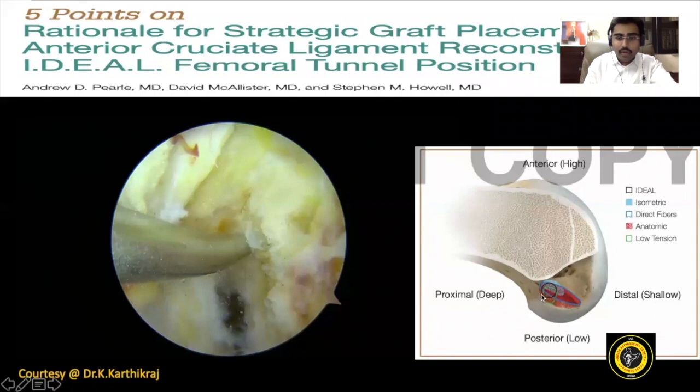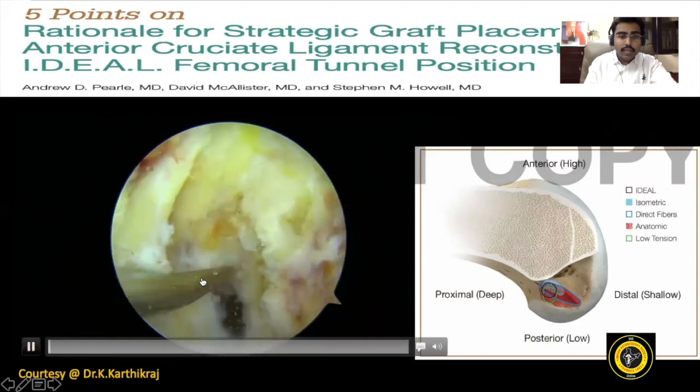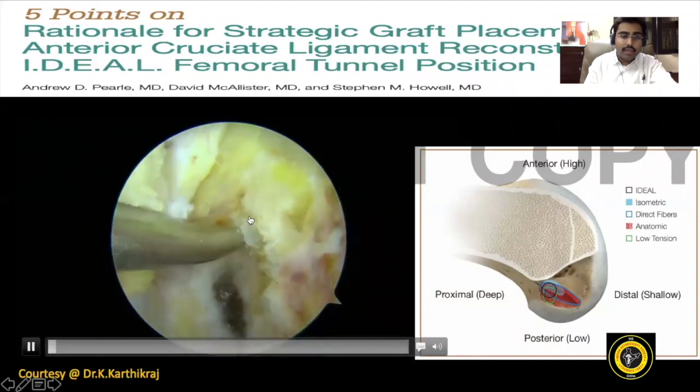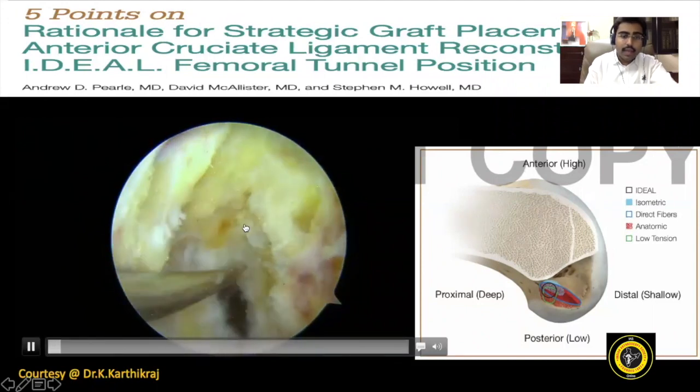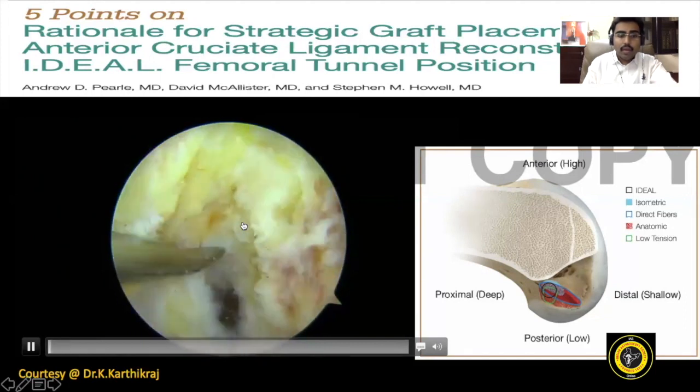Now, that is as simple. If you see the diagram, before I play the video, you have the notch here, the lateral wall of the notch here. So this is the bifurcate ridge. The ideal graft tunnel position is going to be on the black circle, which is just behind the bifurcate ridge on the anterior or the higher part. So let me show you my video. This is where you can see the bifurcate ridge well and clear. Just behind the ridge and high up is the point I always like going ahead.